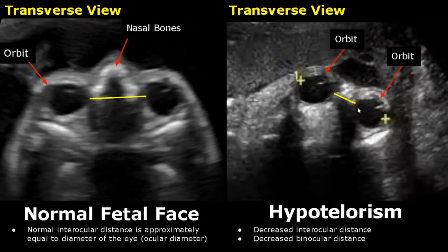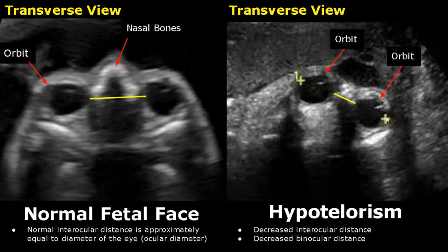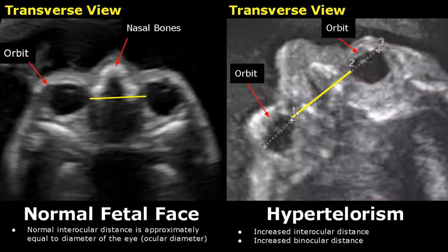The distance between the medial canthi of both orbits is called interocular diameter, and this distance is approximately equal to the diameter of the eye. In hypotelorism, this interocular distance is decreased, and the binocular distance — that is, the distance between the lateral canthi of both eyes — is also decreased; the eyes are closer to each other. In hypertelorism, the interocular and binocular distances are increased, and the eyes are much further away from each other.